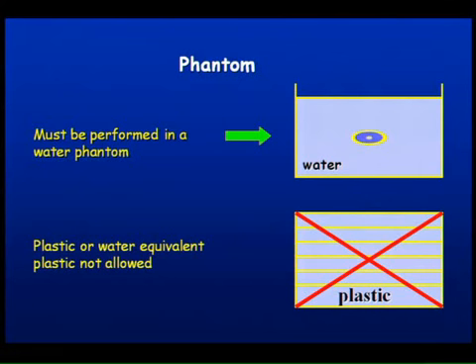But you can use a plastic phantom for routine quality assurance checks, provided you have established a transfer factor for measurements in the plastic phantom during calibration. You calibrated your beam, put in a plastic phantom, put in a detector. For certain monitor units, you have a reading. From then on, you can use that to measure, say, for example, the constancy of the output of the machine.